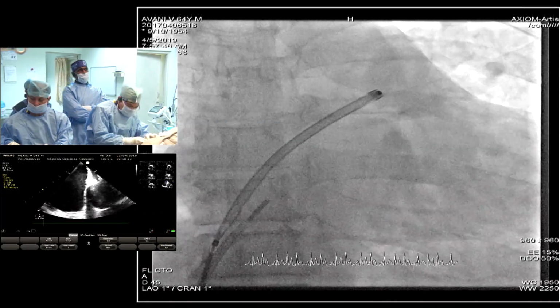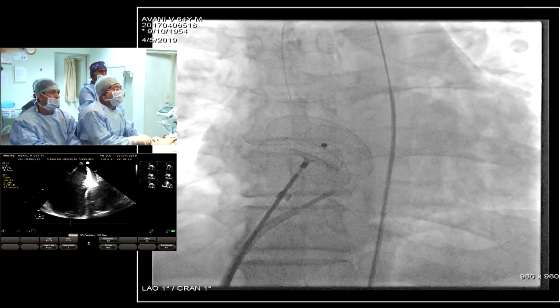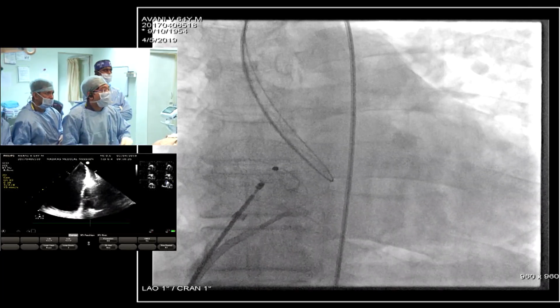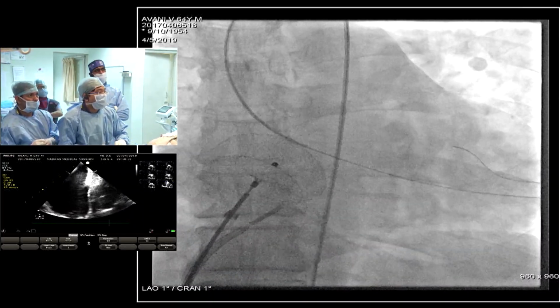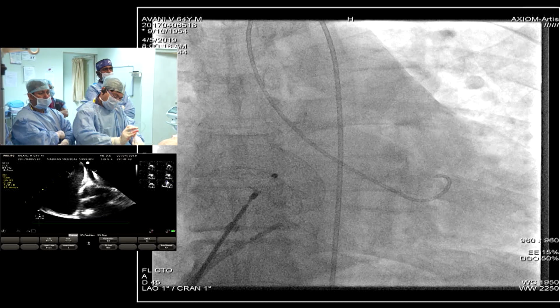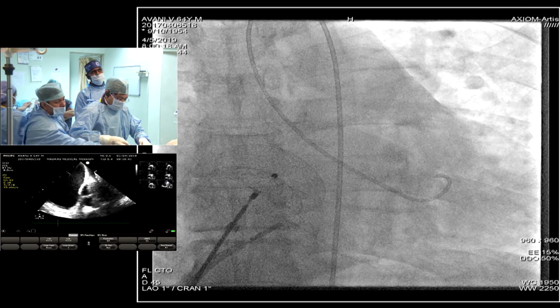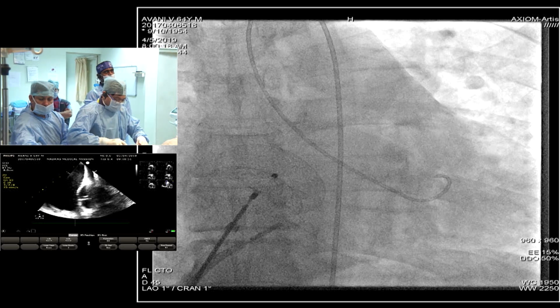However, I would also like to say that if I have an extremely older patient in whom I anticipate a substantial elevation of left ventricular end-diastolic pressure and a restrictive LV physiology, in those patients I do balloon testing to find out the amount of elevation of the left ventricular end-diastolic pressure and the left atrial pressure. Sometimes we take 2 parallel wires. One balloon goes through and closes the defect, and the second catheter is in the left atrium to directly measure the LA pressure.